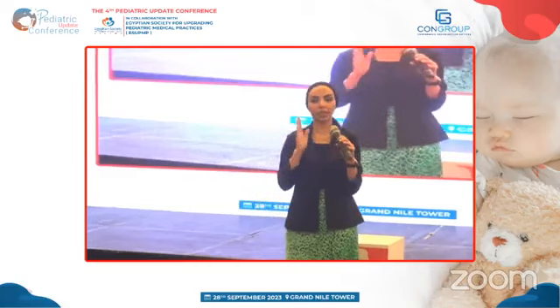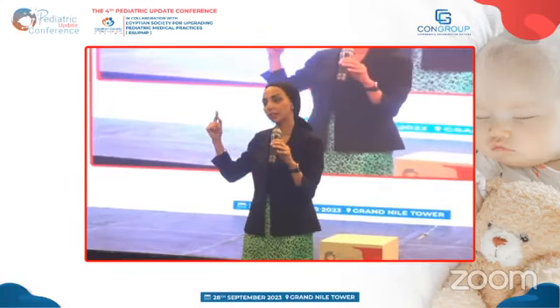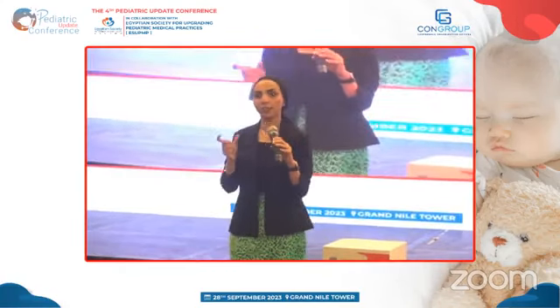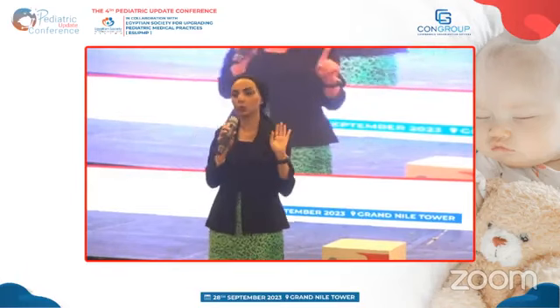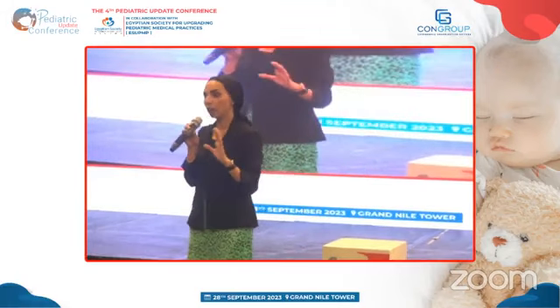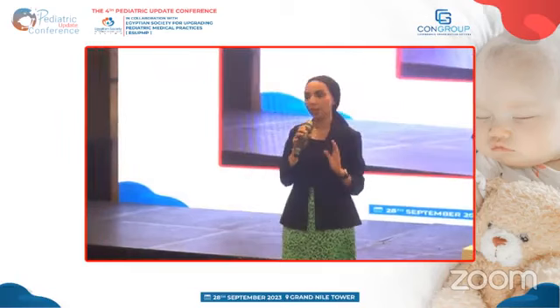للنهار التارجت بتاع البيزل بتاعه 100، فالبيزل هيأكت ان هو كل ما يلاقي الريدينج بتاعه عن ال 100 هيبدأ يزود في البيزل. اوكي، وقت الاكسرسايز او لو في اي ايفنت انا خايفة عليه من ال 100 او ال 110 او ال 120، بعمل له تيمب تارجت، يعني بقول للبامب مؤقتا خلي التارجت بتاعك على ال 150 وما تديش اوتو كوركشن. يبقى انا ساعتها هو في المدرسة، في اكسرسايز، في اي ايفنت، اقدر ان انا اعمل الاكسبشن تايمينج ده لو البيشنت بتاعي محتاجه. فدي كده الحاجات او السيتنجز اللي انا محتاجة اغيرها.